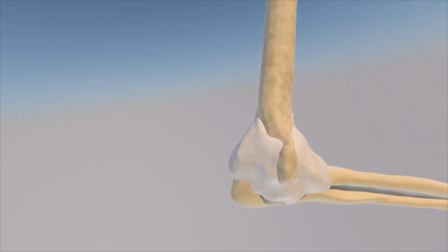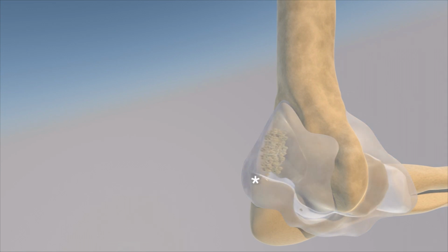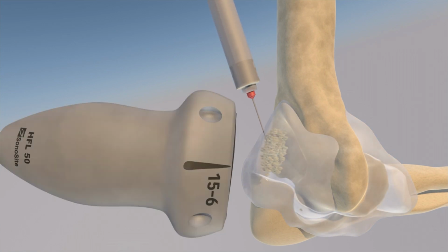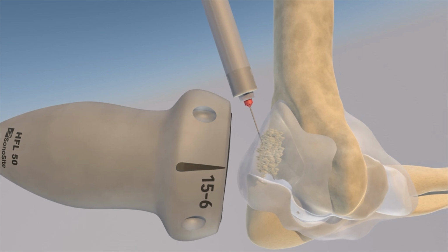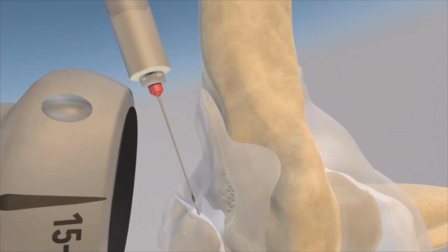Here we're going to go over specifically this procedure. The elbow is flexed to about 90 degrees. Here you can appreciate a distended capsule, and now we're making the capsule translucent. You can appreciate the posterior fat pad. Our needle is going through that posterior fat pad. This is an in-plane approach, and here we're aspirating the liquid out of the joint itself, and now we're injecting a little bit of cortisone.